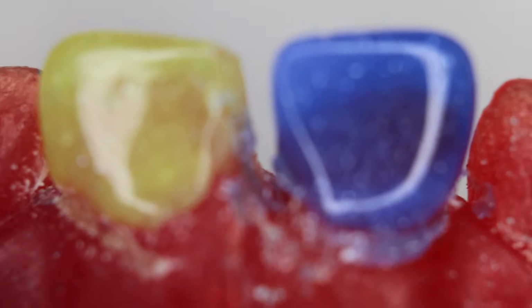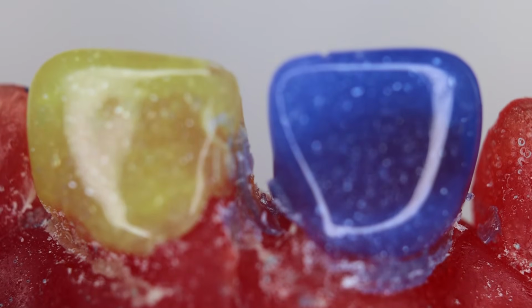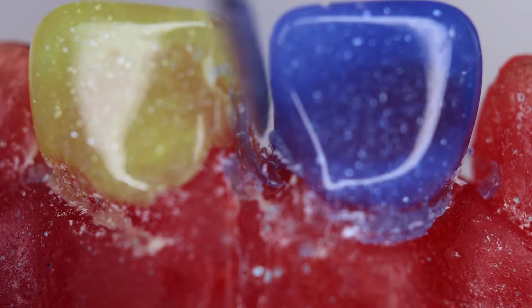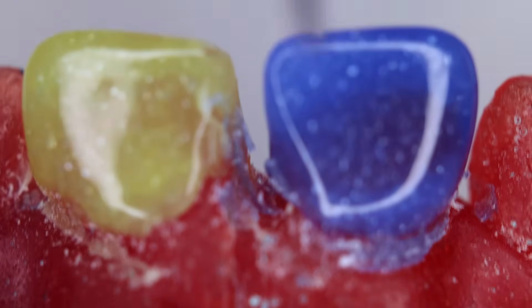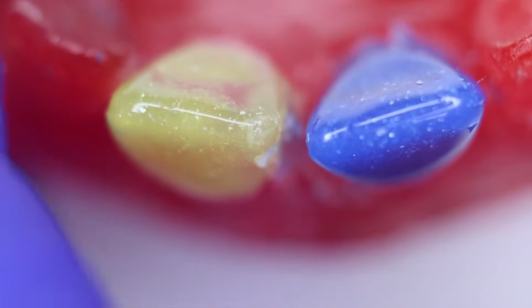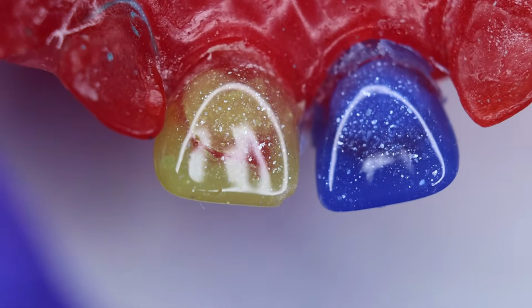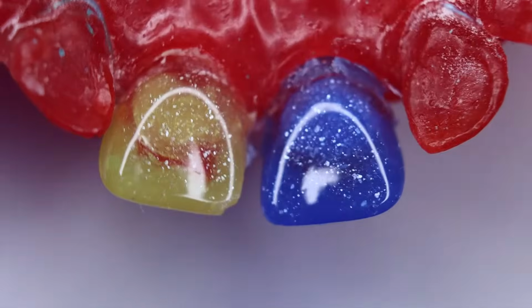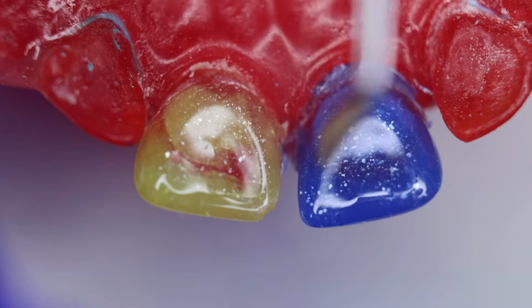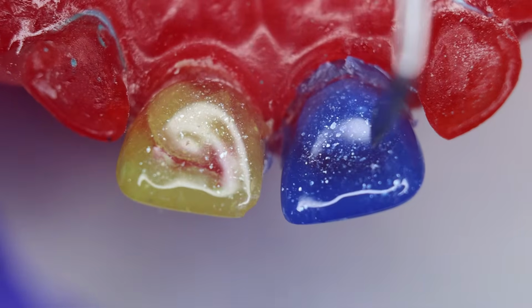So see the shine, the gloss that we have, and we hardly need to do any finishing. Only a little segment is over here, and when we see from the incisal aspect, this is the crown that we see with a good shine, and from the palatal aspect, this is the crown that we see. Both the crowns: this is the blue crown done today, and this was in the previous session.